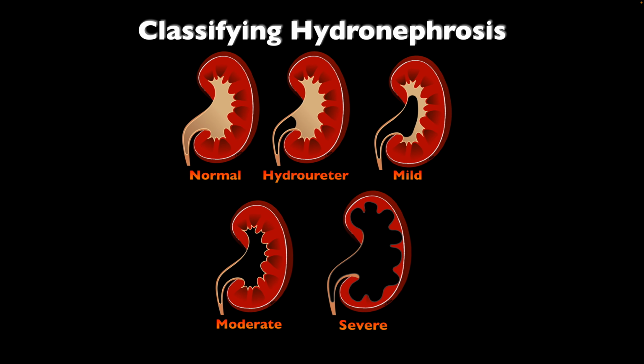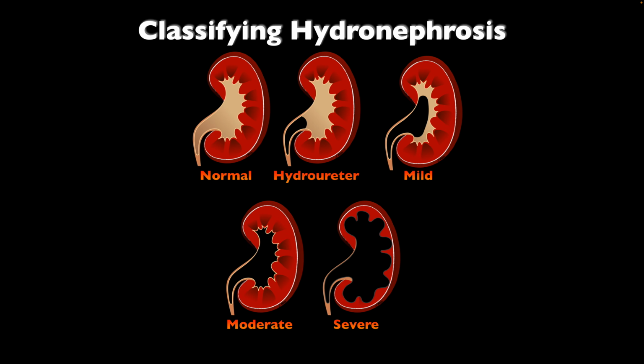All of these are important when, for example, we take ureteral lithiasis into consideration, maybe without acute renal failure, that a person with moderate or mild hydronephrosis could go home. In fact, we discharge many of these as long as their symptoms are controlled. But any person with severe, that should get further evaluation, whether that be with CT or a urology consult. But that should be a focus that we have. Severe hydronephrosis should really raise your awareness or your concern for that patient.